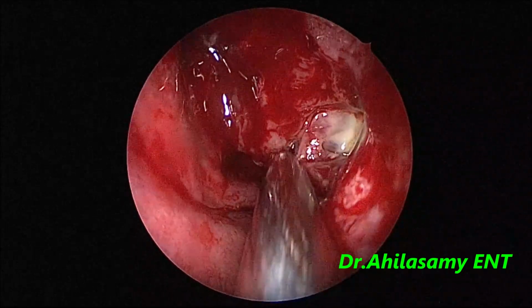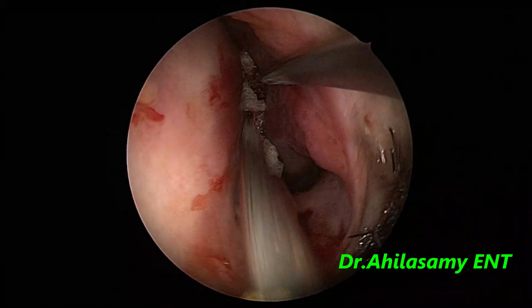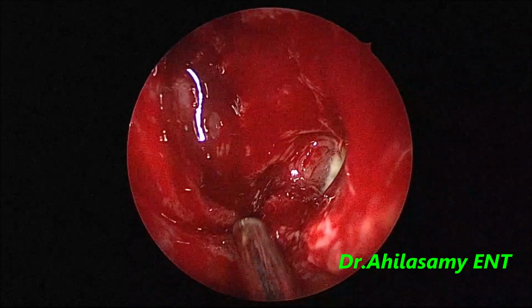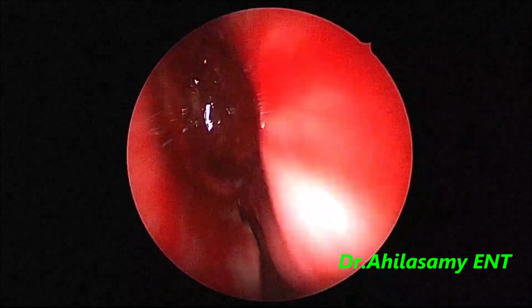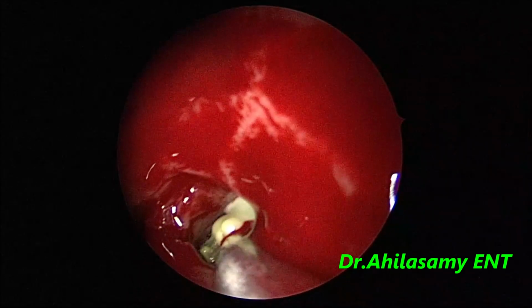See, the melted butter-like fungal material is coming into this section of the debrider. I am again repeatedly packing the area to get a good field. Again, I am using the shaver. A small trickle of blood, I will be asking the patient to swallow.